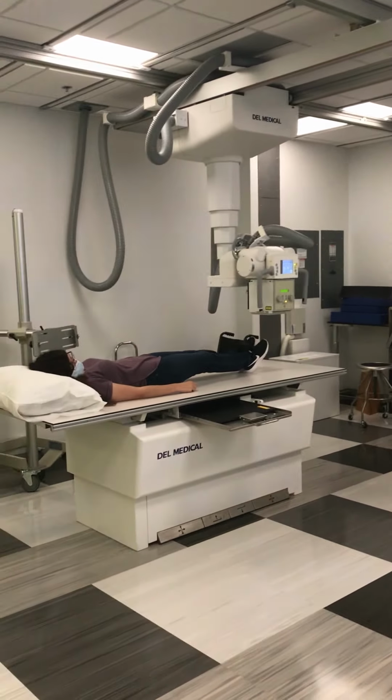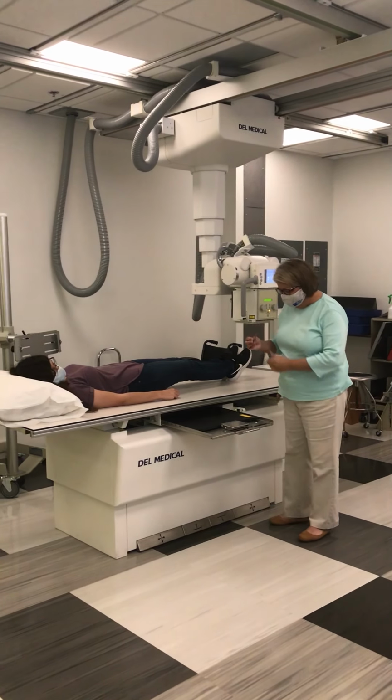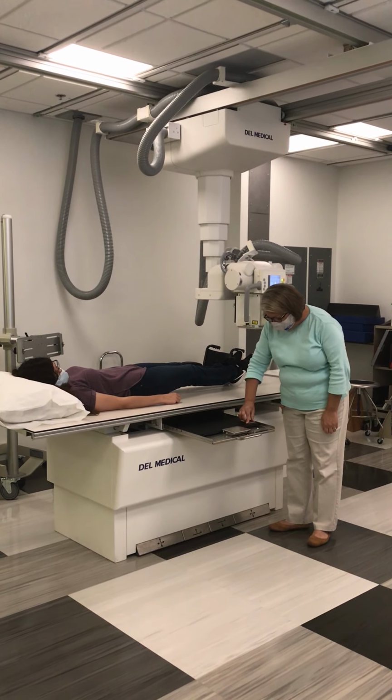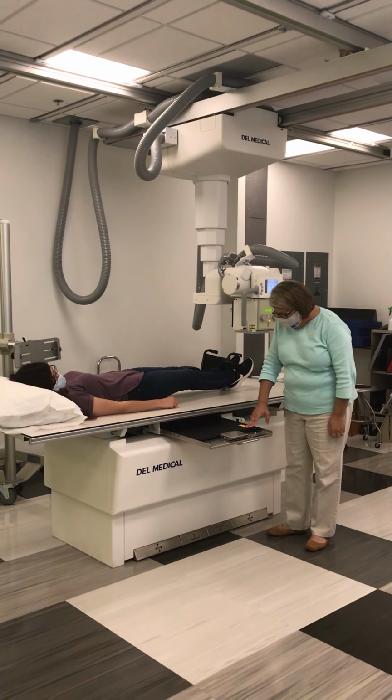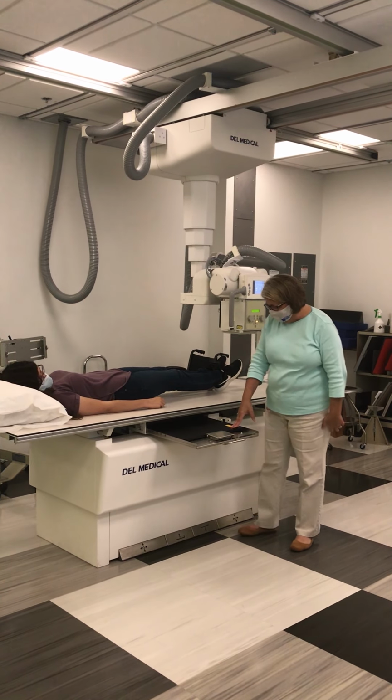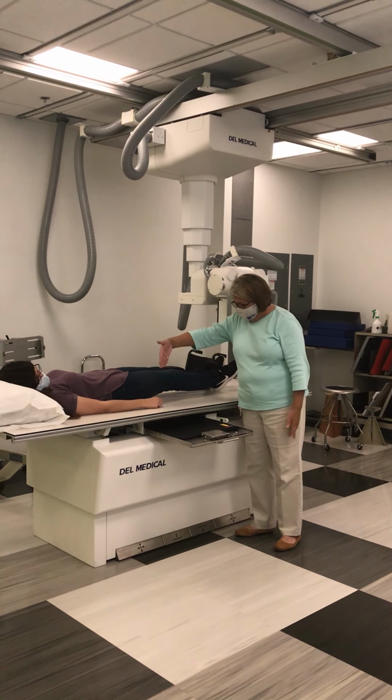Now then, I'm using my right marker for the KUB. I'm placing that right marker inferiorly to the outside edge of the image receptor, and it's going to indicate that this is her right side.